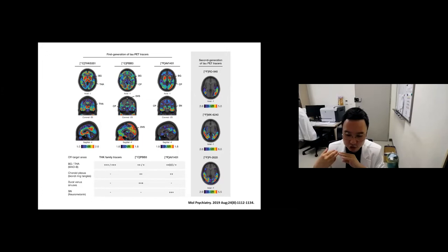And more, so there is a wide overlap in these regions. And furthermore, although we think of the first generation tau PET tracers as very specific to tau itself, their specificity is actually based on the structure of the tau beta sheet. So they can effectively detect 3R, 4R tau helical structure in the brain. However, they have a weak binding to the 3R or 4R tau itself. So it can be hard to detect such primary tauopathies using the first generation tau PET tracer.